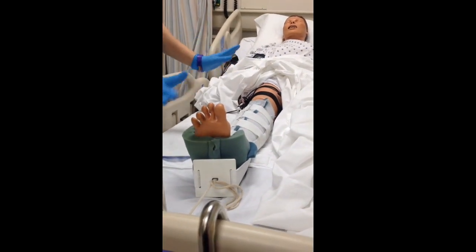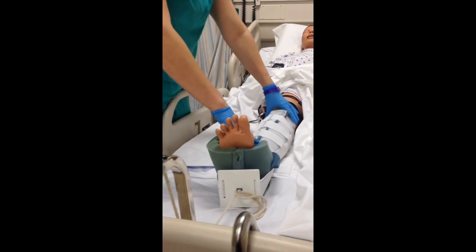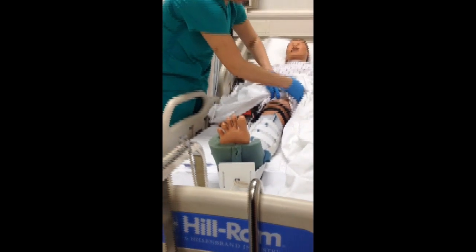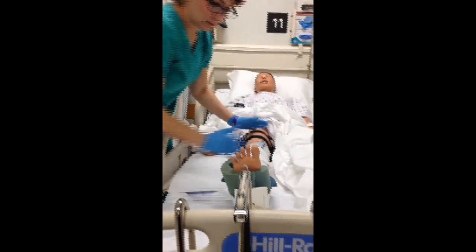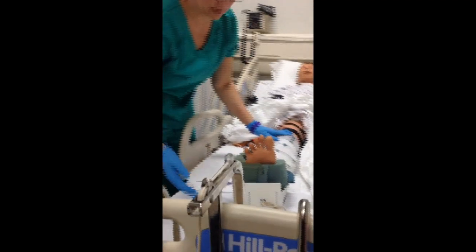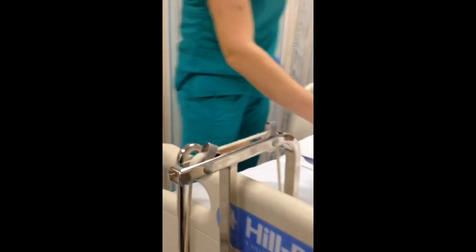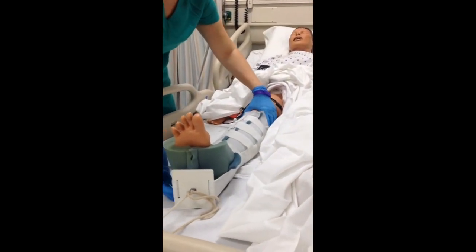Are you having any pain? No, not really. Are you feeling like you're having any muscle spasms? No. The alignment is good — straight with the hip, everything's at a 90-degree angle. There's tension on the rope. The weight is dangling — it's not on the floor or sitting on the bed mattress. Toes are facing the ceiling. Knee is straight up.